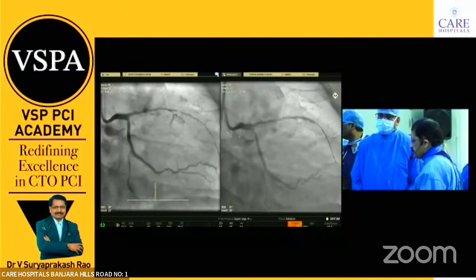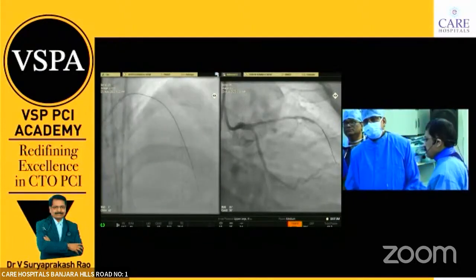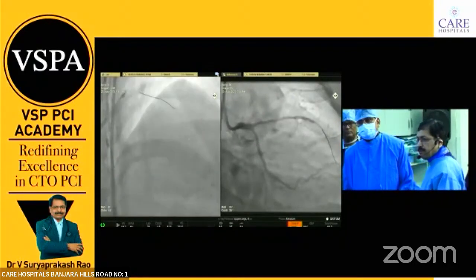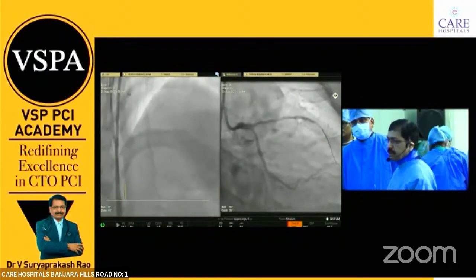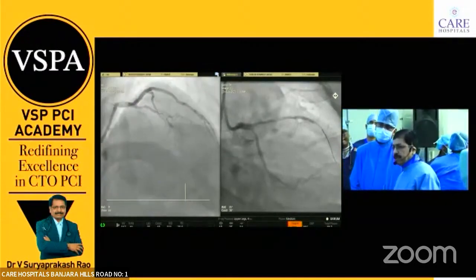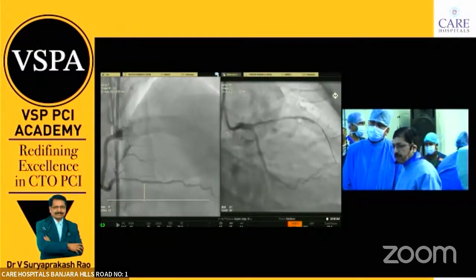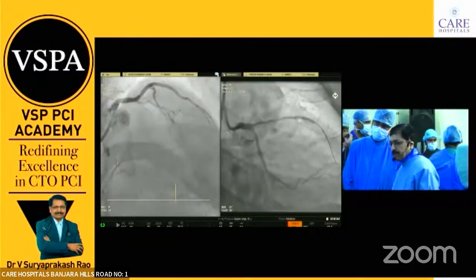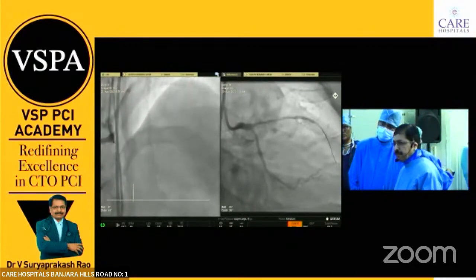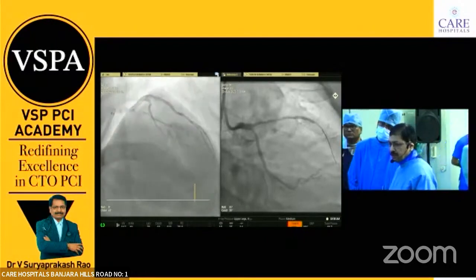He is very young, 32, with risk factors of morbid obesity, more than 100 kgs weight, and family history. He went with acute coronary syndrome to another hospital with a circumflex occlusion, which was opened and a long stent was put in, and the LAD was found to be a CTO. The retrograde vessels, collaterals are not that happy. If you see, there's a PDA disease, RCA is okay, but the exit and entry points of the collaterals were distal, and the distal LAD also appears diseased.